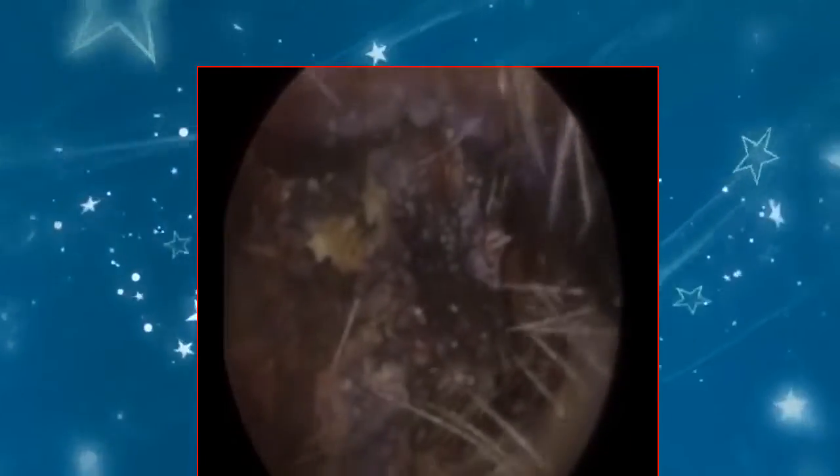The problem is when you've got a hard boulder of wax like this, sometimes when you use an ear hook or a Jobson horn, you could accidentally push this boulder of wax further in the ear and against the eardrum, so we do have to be slightly careful here. So I'm just trying to bring it a bit more further forwards. There's a bit of a gap there at the top, and I'm now going in with the St. Bart's ear hook, trying to get in behind that boulder. However, the space is still not there, and it actually did push the wax slightly further in. Therefore, I'm using the Solner suction probe again, trying to get myself a grip, bringing this wax slightly further forwards, and I believe in a moment I'm going to use a Jobson horn.